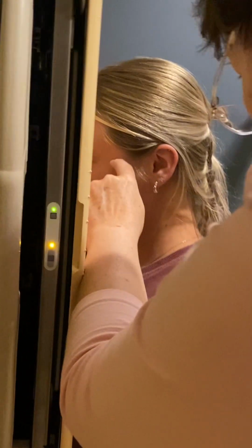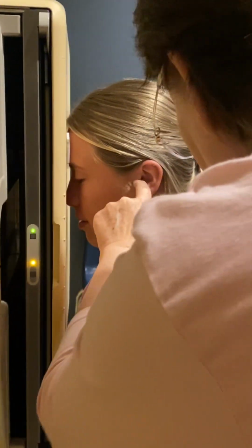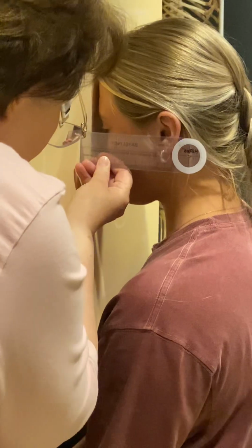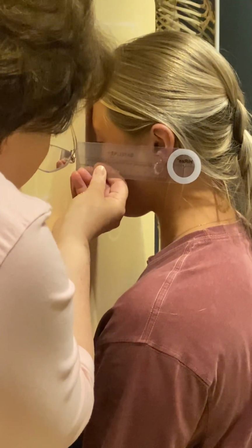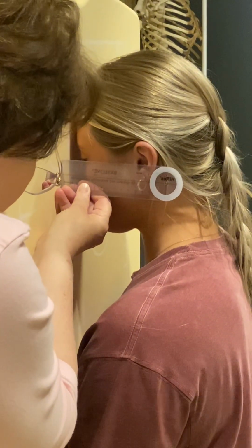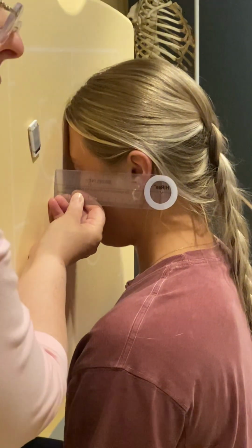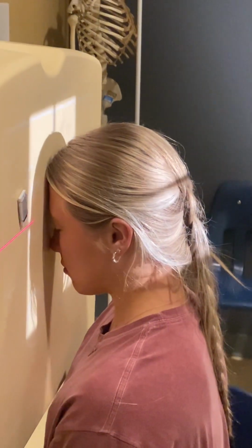All right, and so I'm looking at the EAM, and I'm looking at that outer canthus right here, right? So there's the EAM, there's the outer canthus. All right, let's look down only a smidgen. Look down just a smidgen. Good, right? That looks really good. So we got OML perpendicular to the image receptor, so that's great. We got our 15-degree caudal angle, and now we just want this to exit the nasion, and we know where the nasion is.